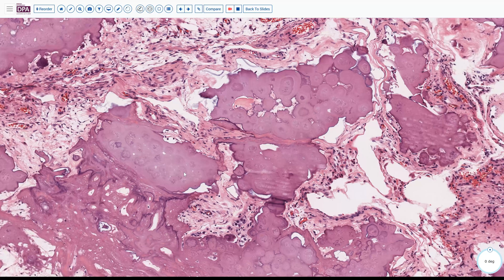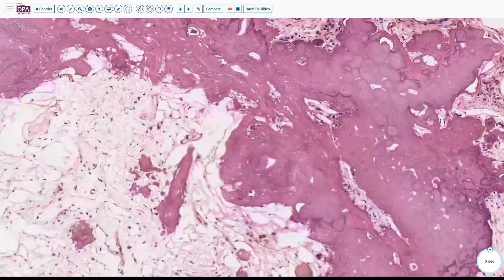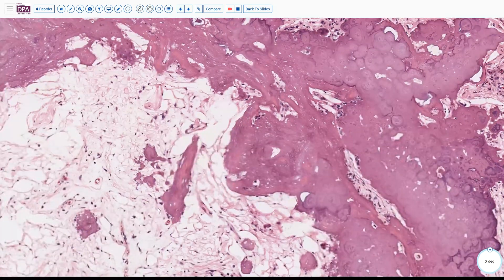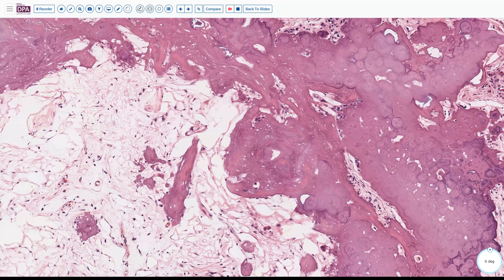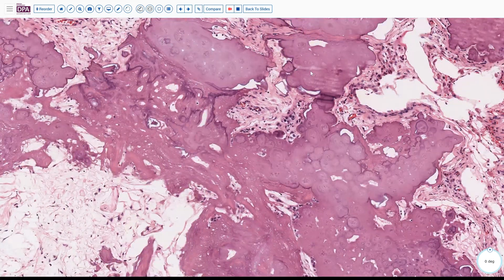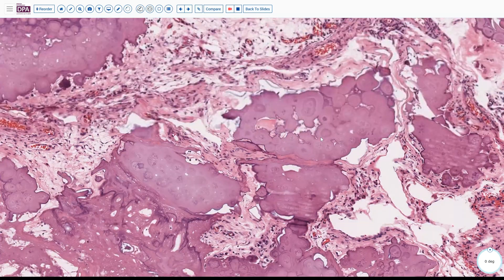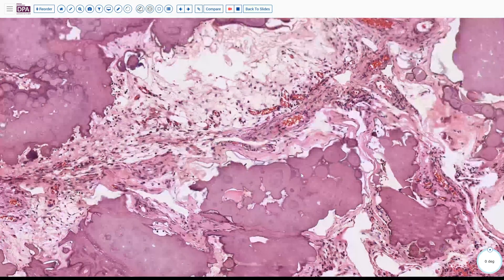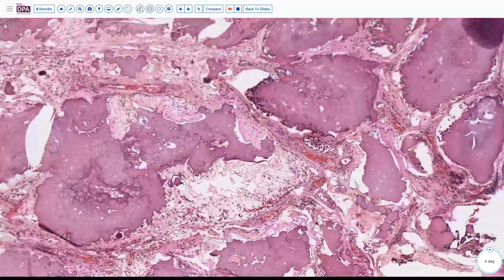Towards the periphery we see ossification occurring, with a loose fibrous marrow formation and perhaps a few osteocytes forming as the process continues. Pulling back out to the periphery of this lesion, we find an area where there is maybe a little bit of ongoing cellularity remaining.